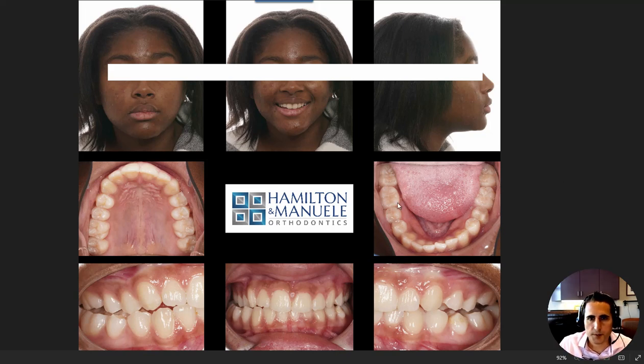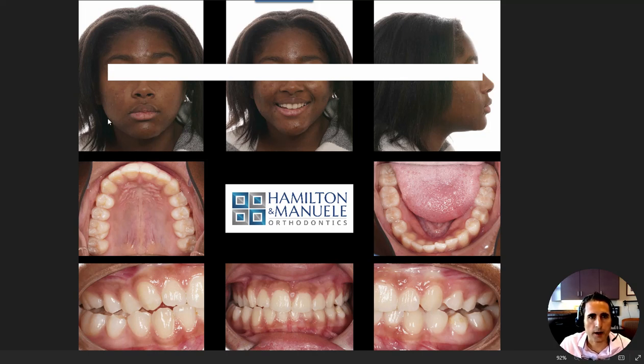Hey guys, I thought this would be a fun case to review together. There are a couple of things going on here, and this may be something that you see in your practices often as well.